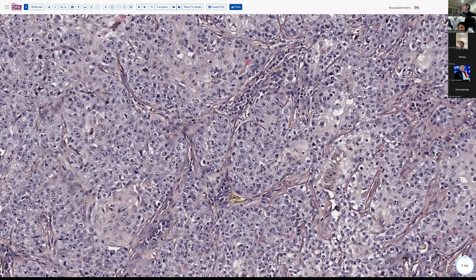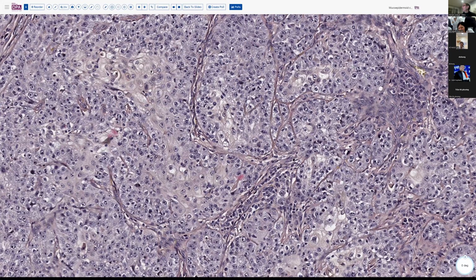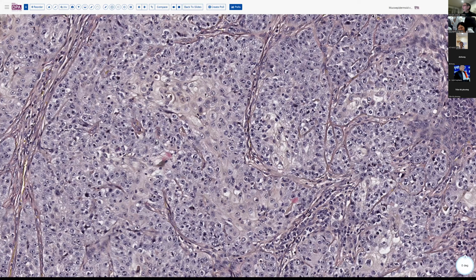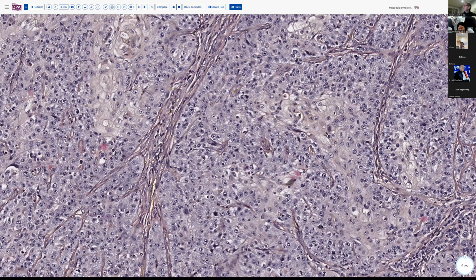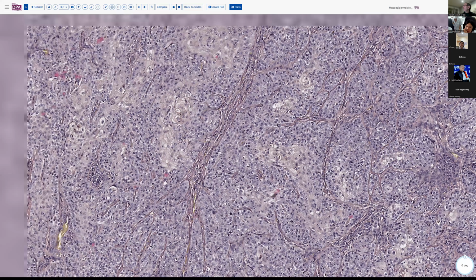I believe this is a mucicarmine stain, just based on the coloration here. So you can see how just little bits of mucin, like right here, stand out with this stain. Here you see another cell here. So the squamous cells here, the intermediate cells, and rare mucocytes, a little bit of positive blush with the mucicarmine stain can be very helpful in these situations.